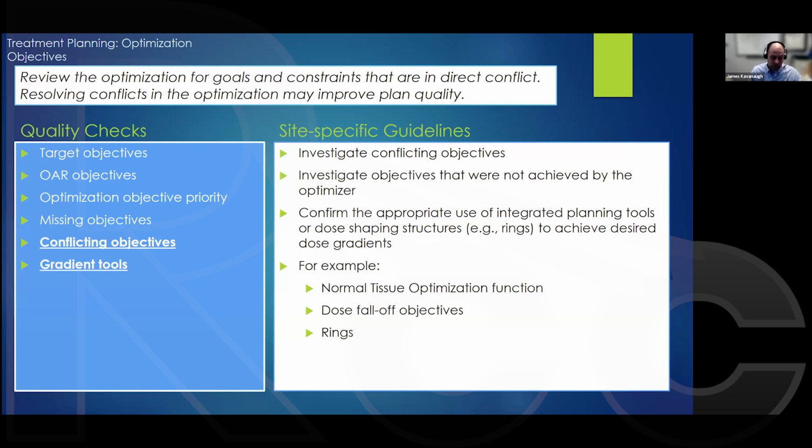We typically will do, just because we will have this anyway, an MR for when we want to visualize the urethra, which is almost exclusively within our prostate SBRT treatments. We'll do an MR. With the appropriate techniques, we can clearly visualize it on the MR, and that will be in or close to the treatment position. So we don't have anything physically disrupting the urethra itself. Contour it, and then note it does also just kind of shift day to day.